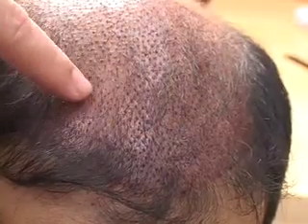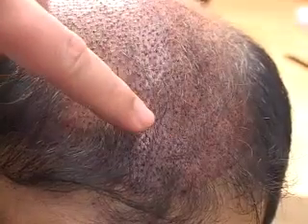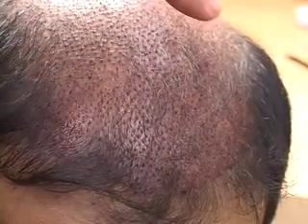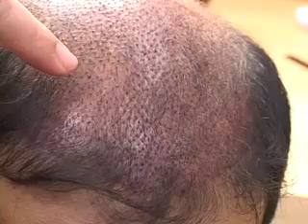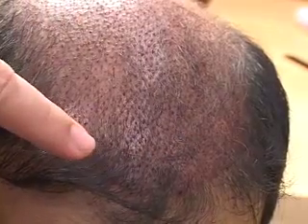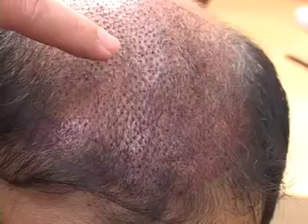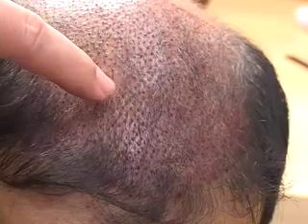This is all highly dense grafts that will provide equal to two grafts for every graft that you're looking at right here. The hairline has been recreated very carefully, and what we're going to show is some of the way that these grafts are placed.